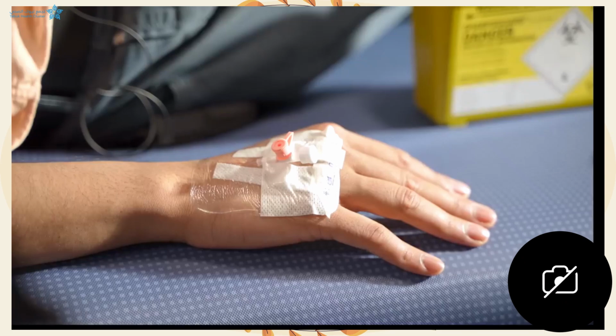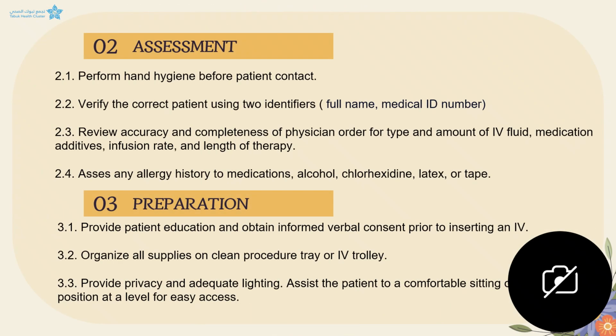Okay, so we will start with our assessment. First, of course, infection control. You have to perform your hand hygiene before patient contact. Then you have to verify the correct patient. We are using two identifiers, full name and the medical number.